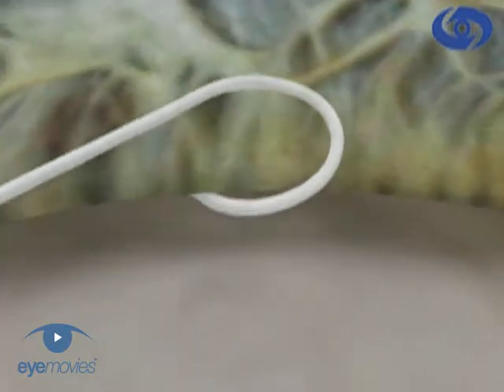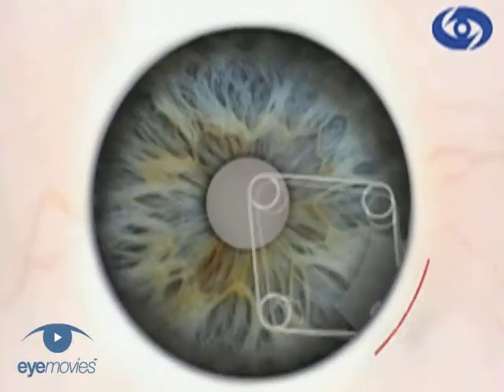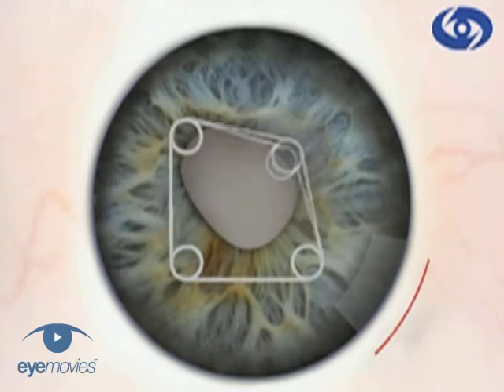The loops are designed for easy fixation, and they hold the iris relatively atraumatically on a gentle but secure stretch.